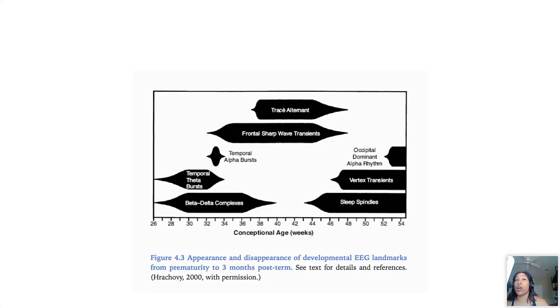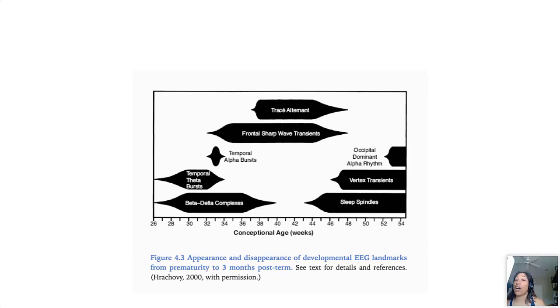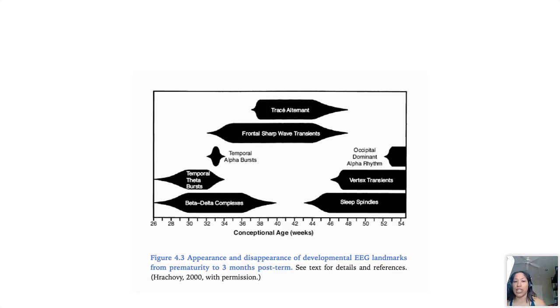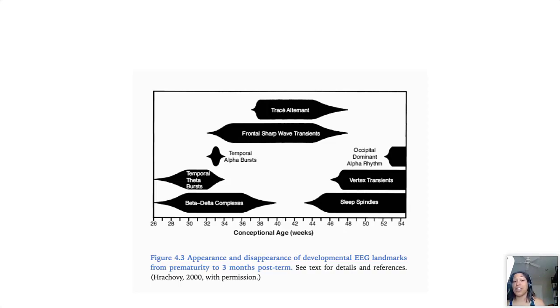So once again I want to review this chart because it's so important and it helps us understand what is normal and what is not normal in neonates and premature babies. So these are the grapho elements that we expect in neonatal EEGs and this is also from that Eli Mizrahi textbook that's really helpful.